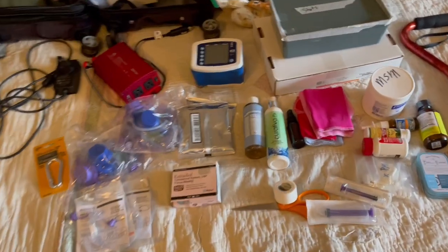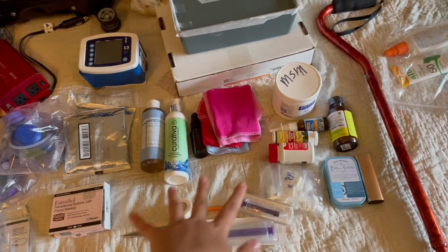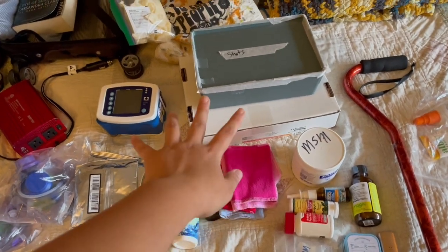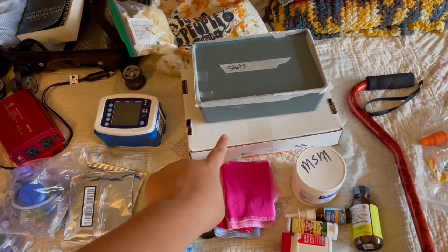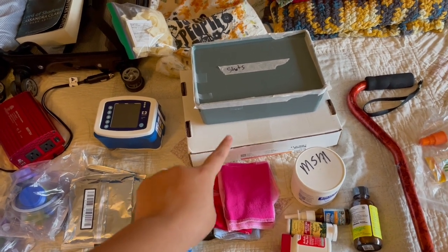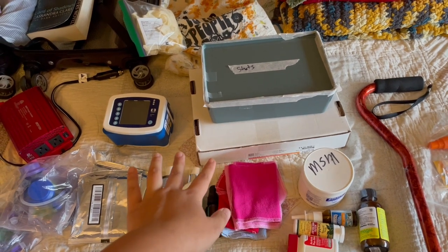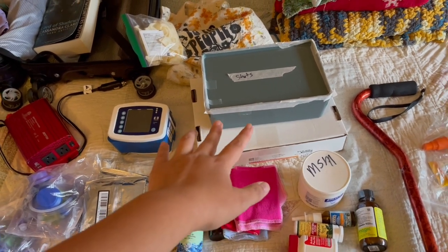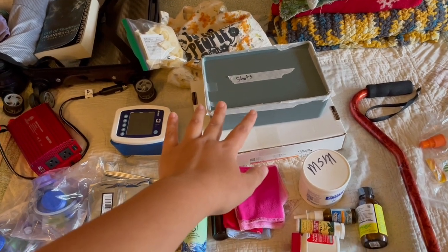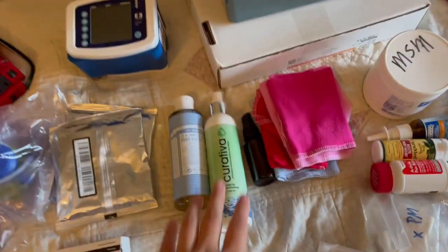Over here we have some meds, some scissors, some tape, some syringes. And then I bring a spare feeding tube with me, because whenever I go out of town I always bring one in case my tube falls out and I need to have something to hold my stomach open until I'm able to get a proper tube change. Then I bring my emergency meds and I bring gloves with me.